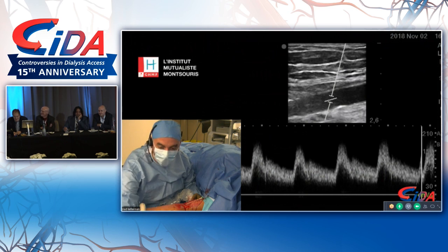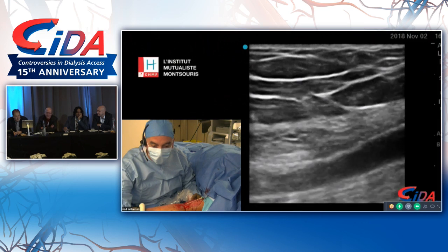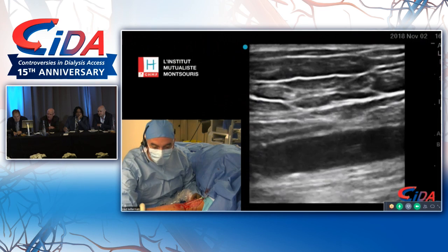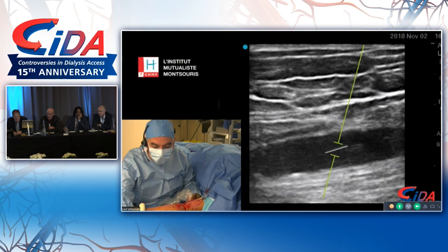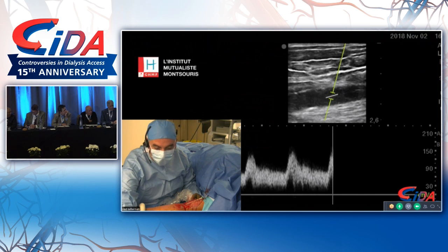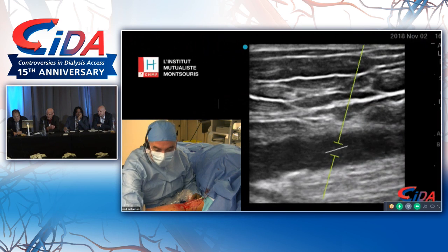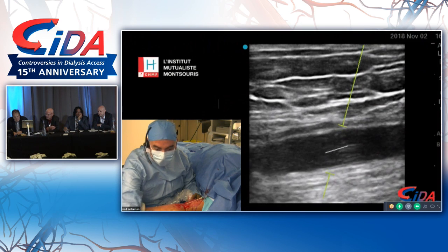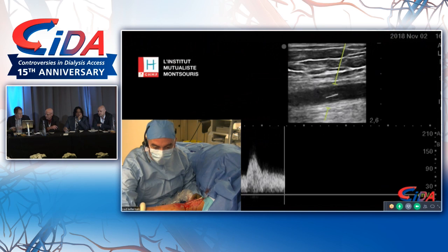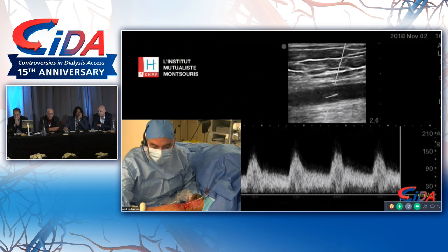Jeff, any comments about outpatient, inpatient, and so forth? Because the U.S. trial, I think, was all outpatient, wasn't it? Right, all outpatient. Alex says it took some 10 cases, but you have to realize that this method of going down transverse is not how we taught him. We taught him to put a wire down and to move the needle over the wire. So he independently developed this transverse technique during his, quote, training period. So Alex, you've really moved this technique forward.